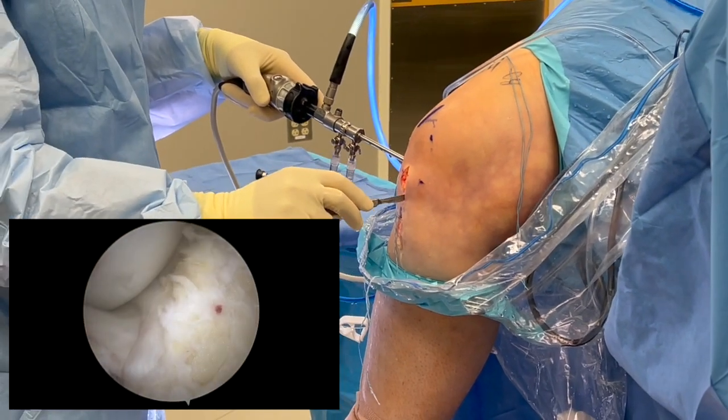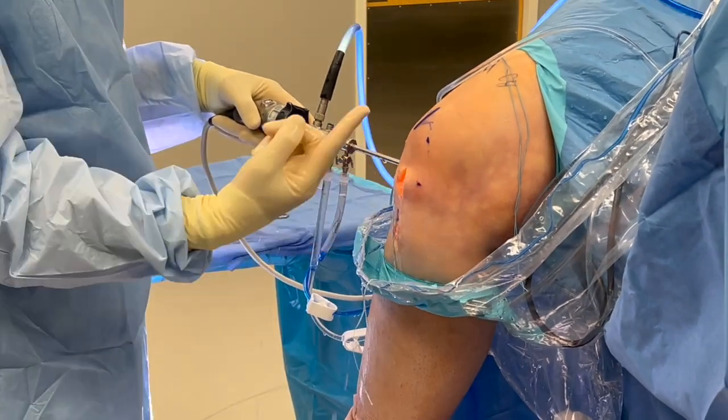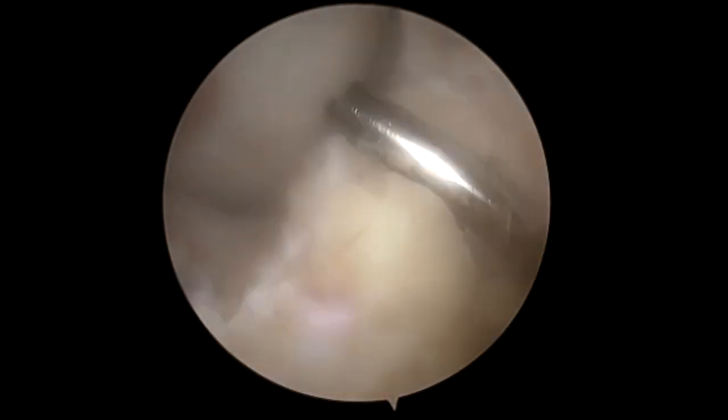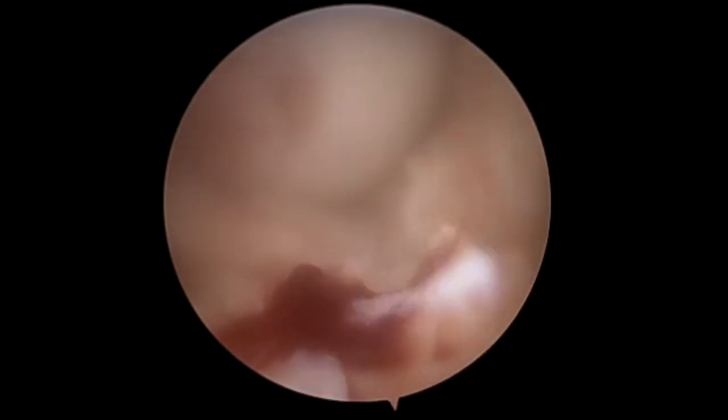We're going to make our arthrotomy — first with a knife, then dilate with a finger to make sure we can get the BEAR implant in. Then we're going to clean this with a shaver to allow for easy passage of the implant. Following this, we're going to take the passing stitch we used and pass the internal brace.